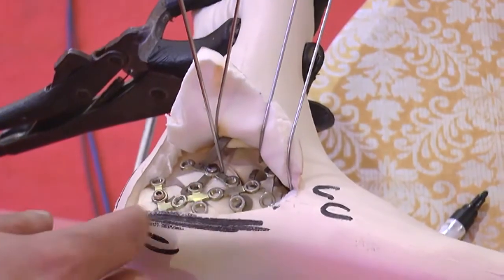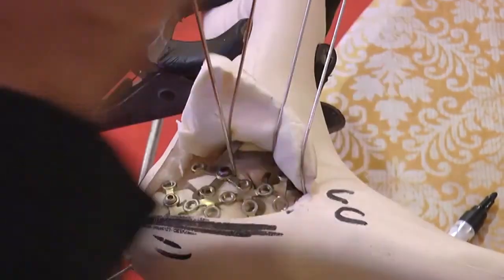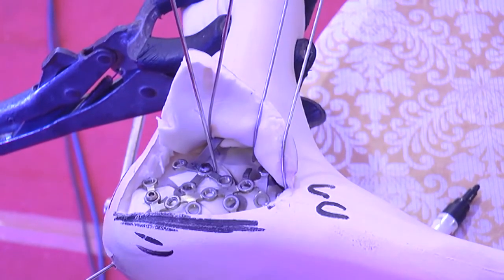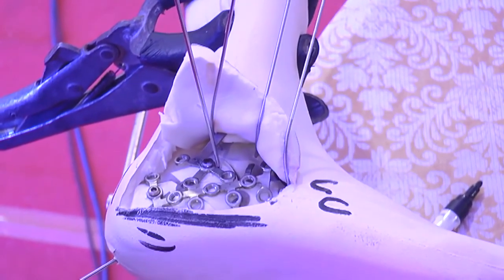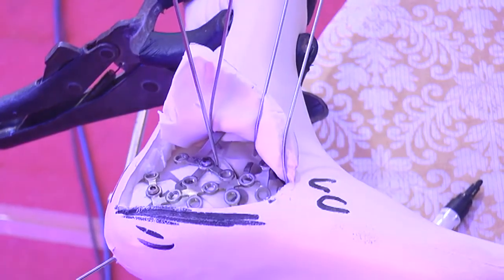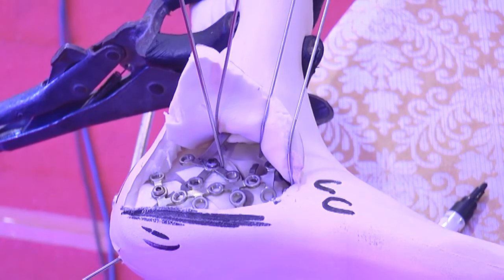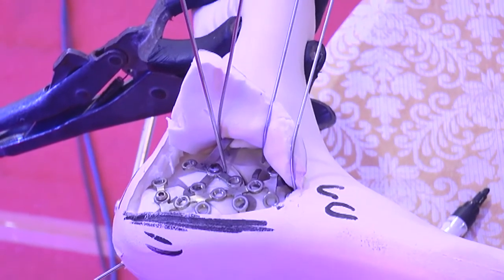And then in the end, obviously, give a good wash and do a very good closure. I generally prefer to put a drain in all calcaneal fractures. Some people may disagree, but I've seen a lot of difference when you do not put a drain versus when you put a drain. A negative pressure drain, a Romovac.